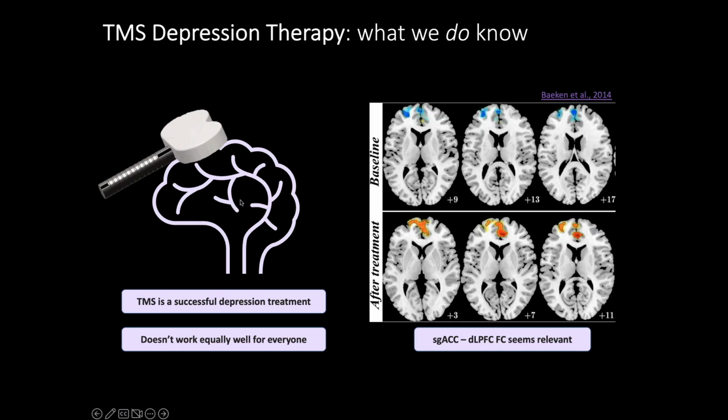But what we do in TMS is that we are targeting a cortical region, the dorsolateral prefrontal cortex, mainly because it's just a region that we can target with TMS because it's on the outside of the cortex. But the actual antidepressive effects are not because we're modulating the dorsolateral prefrontal cortex activity. This is not the depression region. It is only because this region is a window, a door into a wider-ranging network, including many subcortical regions that are connected to that stimulation site. And therefore, by having this network effect, we also have the antidepressive effects.